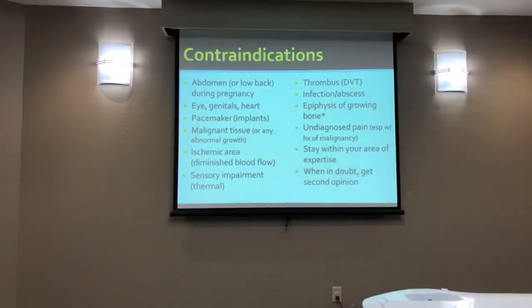I have a question, Jamie. Has anyone ever looked at, if you go into a thermal effect and you want to get heat to ligaments and tendons, why not just put them on a UBE or exercise equipment and warm them up? I'm not a big advocate of ultrasound. If I use it once a year, it's probably a lot. I did wound care a lot, but I need to know this actually works.